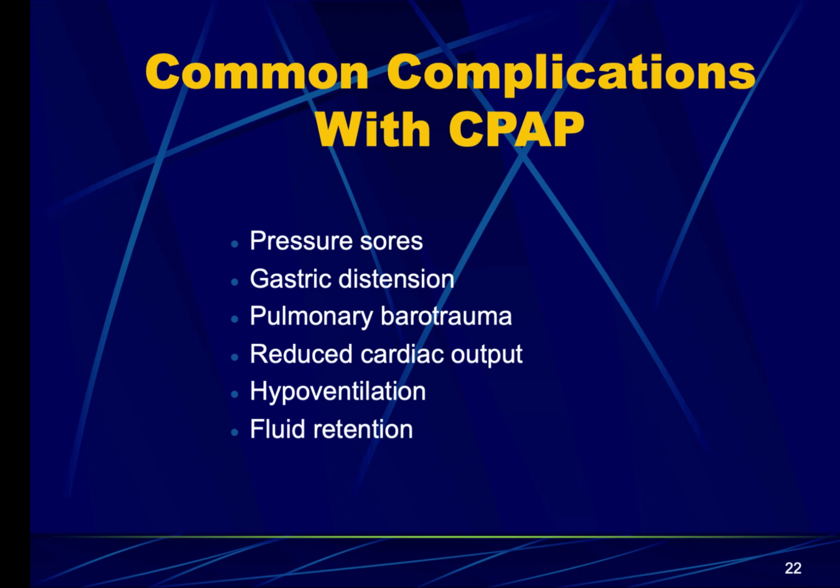So let's say we got this little old lady, right? She's complaining of shortness of breath. We hear fluid in her lungs. She might be satting, I don't know, high 70s or something like that. We really don't have any wheezing associated with this. She's just got fluid in her lungs due to a history of whatever, CHF, okay? So we explain the process to her. We throw her on some CPAP, and we start off at PEEP of 5, right?